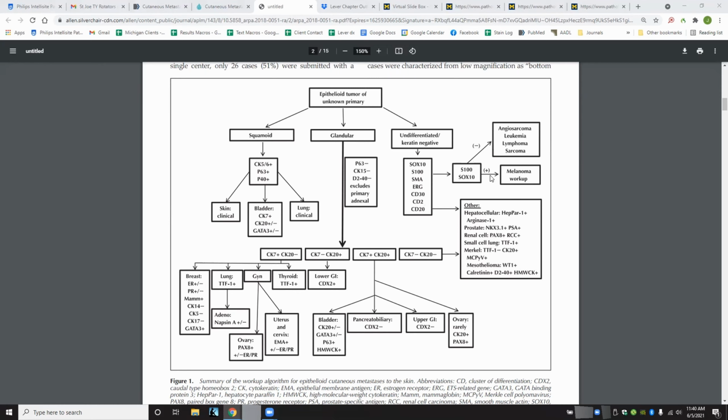So this is a really helpful table for approaching a tumor of unknown primary in a patient who has no history of primary neoplasm elsewhere, and just kind of the general approach that we use when ordering immunohistochemistry. So right off the bat, you're not going to order every immunostain or the whole panel. So we start off with a very basic panel. If we can find any foci of a particular differentiation, you really try to limit your panel, and we'll order a bunch of unstained slides. And then as we get back bits and pieces, we'll order a little bit more. So you don't start off ordering every stain in this table.